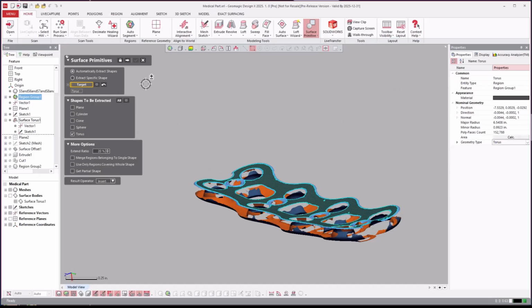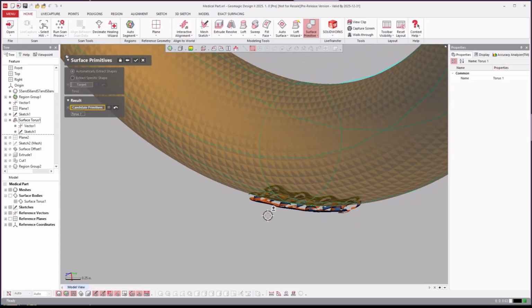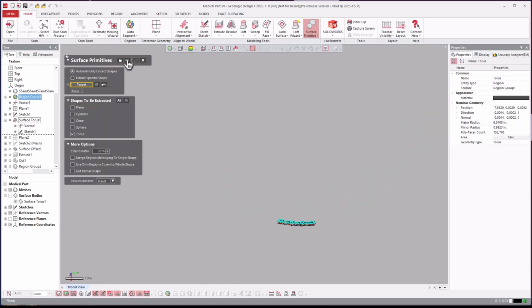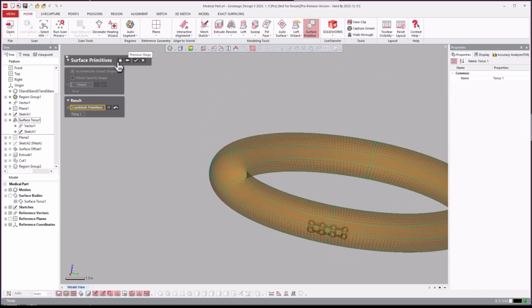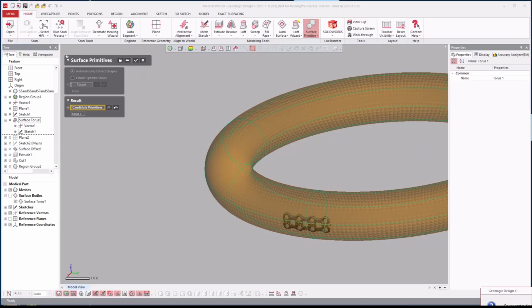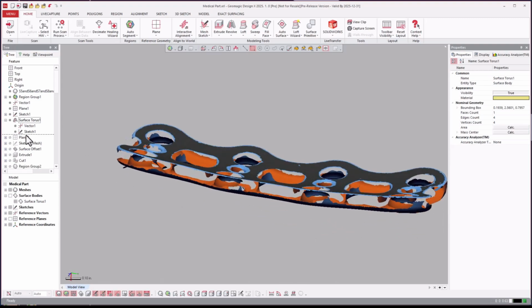And then you come over here, select torus, select that region, you hit next, and you see here you can adjust. I did surface primitive, but I can also reduce this down to 5%. And you see here it's creating the entire torus right now. But the idea here is that it can extract it for you automatically. So just cancel out of that. I'm not going to actually extract it. So there we go. Extracted the torus.